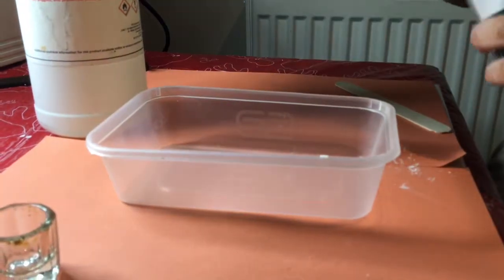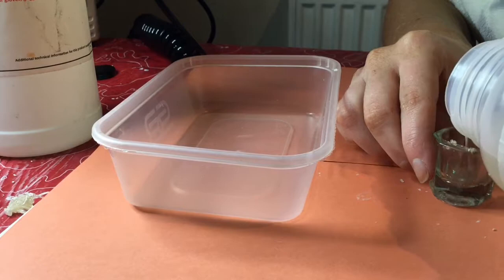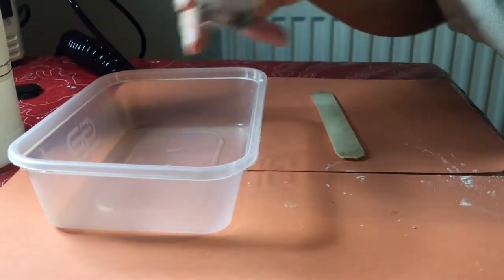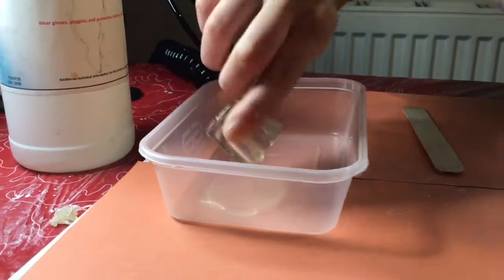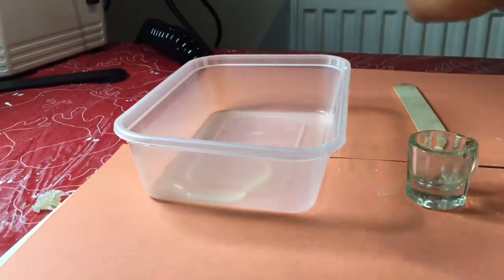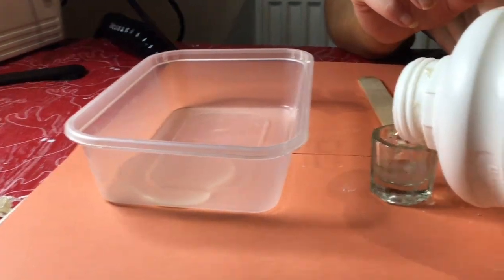In this video I will be showing you how I created my prosthetic nose from silicone. Before I began, I took the advice from Stephanie Kent that she gave me in a recent interview. She explained to me how important it is to double check that you have everything you need in front of you before you begin making your pieces. This is due to the fact that the silicone begins to cure as soon as it is mixed.